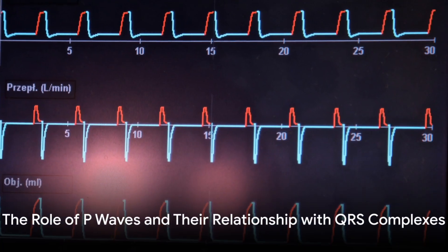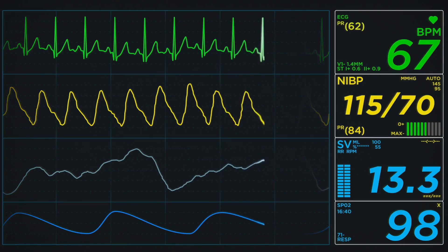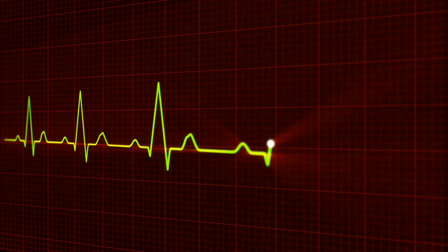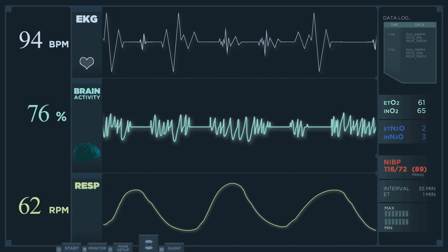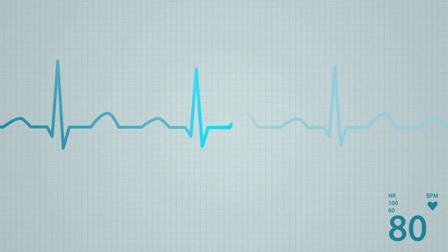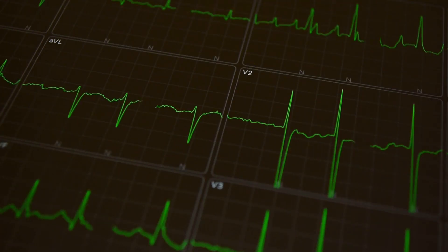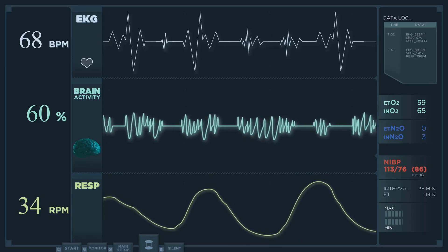Are P waves present and upright, and what is the relationship between the P waves and QRS complexes? P waves represent the electrical impulse traveling through the atria, or the upper chambers of the heart. Its relationship with the QRS complex, which signifies ventricular depolarization, is vital. A consistent one-to-one relationship indicates normal sinus rhythm. But if this pattern changes, it could be a sign of an arrhythmia.